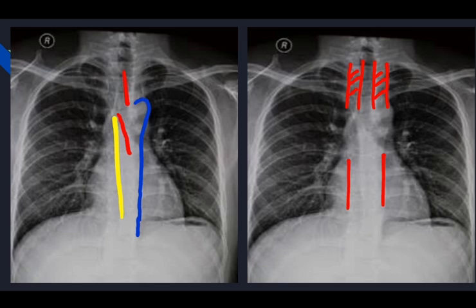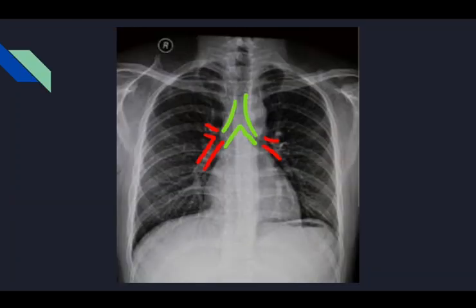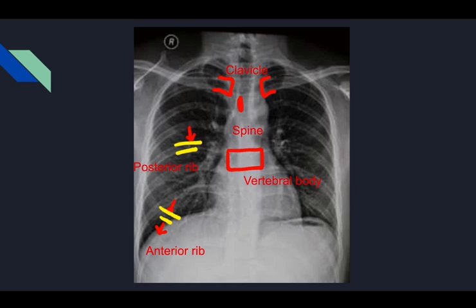There are also right and left paravertebral lines, which are stripes — areas between two lucencies — since both the trachea and lungs are air-filled structures. The area between these is called the paratracheal stripe: right and left paratracheal stripes. The trachea is an air-filled structure that divides into right and left bronchi at the carina. The right bronchus divides into the right upper lobe bronchus and bronchus intermedius; the left divides into the left upper and lower lobe bronchi. We also see the shadows of the right and left pulmonary artery branches.